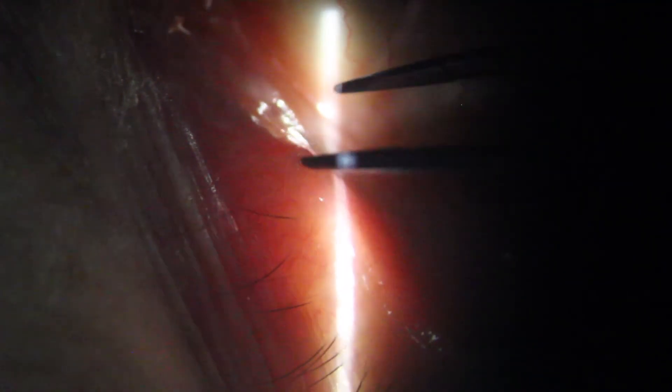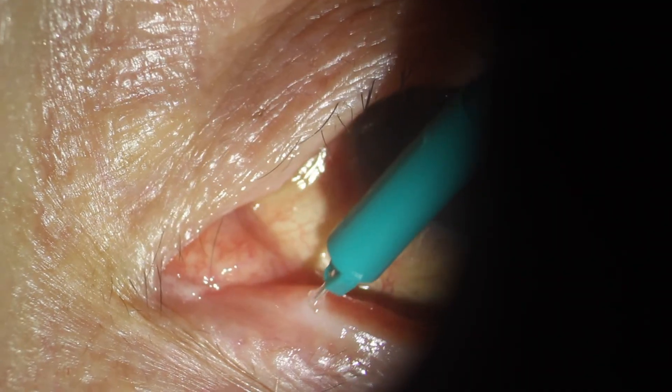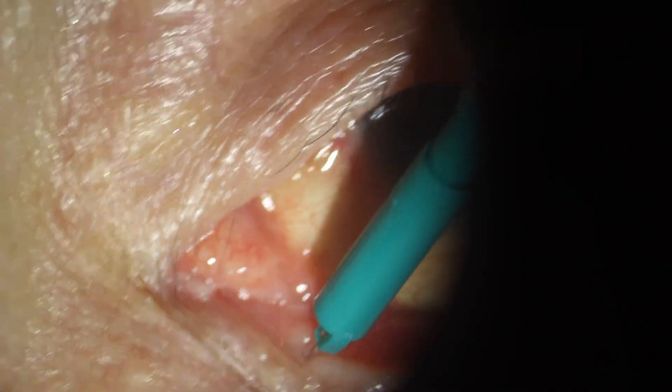Patients do not feel these. Now I'll demonstrate a permanent plug. These are non-dissolving and made from silicone. They can cause some irritation for seven to ten days, and it's important to warn patients of that.